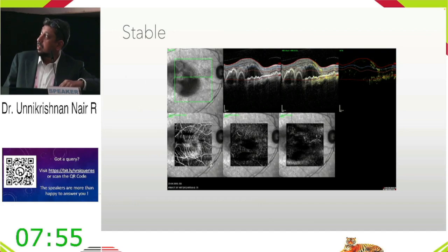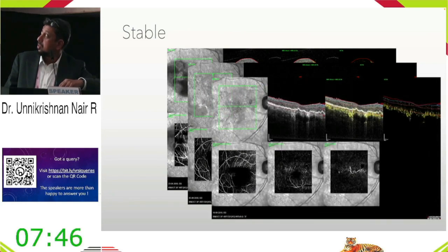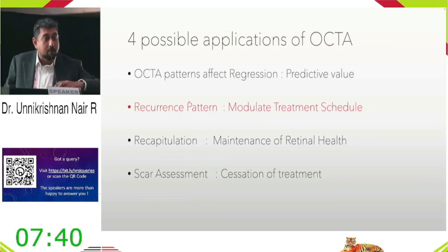So this is just an interesting example of a particular lesion. You can see that once the lesion dries up at this particular point, you see a blood vessel. And even though the lesion appears bright throughout the blood vessel, the main central core blood vessel still remains. And that is one important thing that you look for: the nature of the blood vessel.